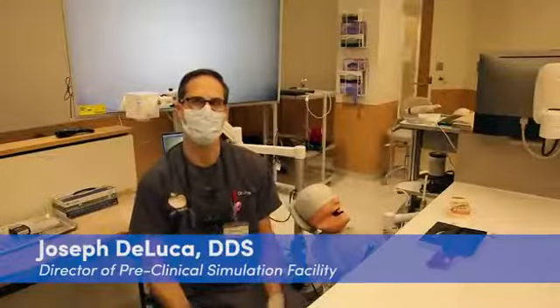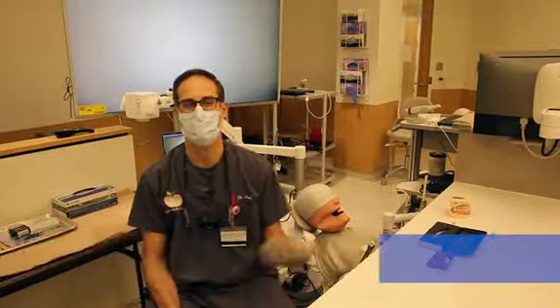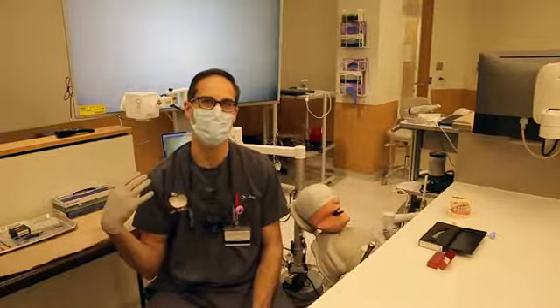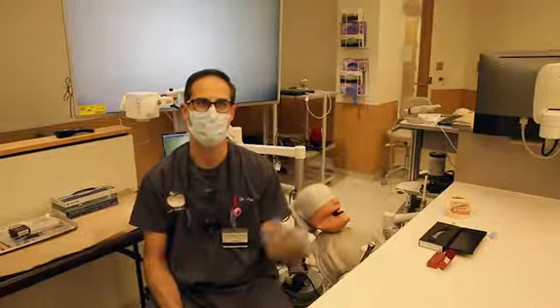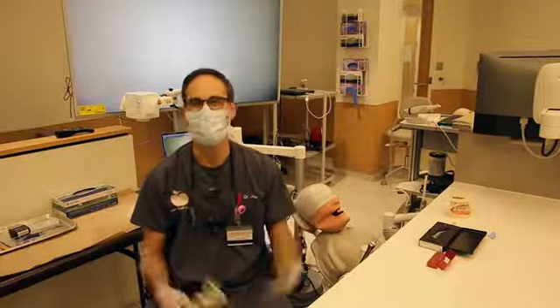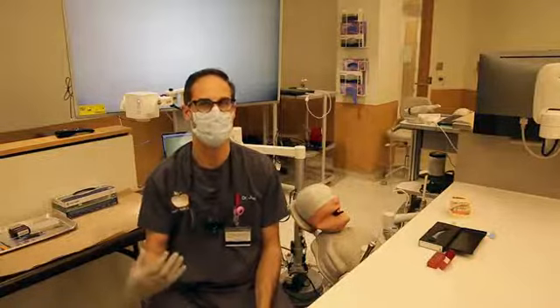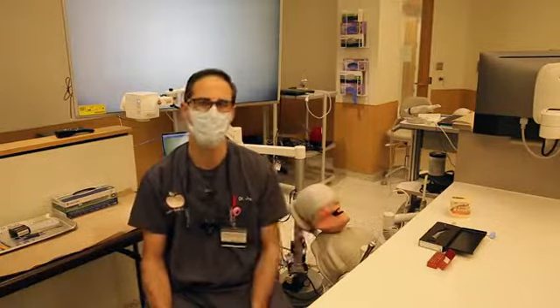So welcome everyone. I'm going to show you a couple of things that we are doing here at the University at Buffalo involving our 3D CAD/CAM technology that we use in the clinic and in the pre-clinic in order to train our students, and also some of the 3D imaging, video imaging that we have in order to teach our students in a more friendly environment, we'll say, an environment where we can actually evaluate student work and give feedback in real time, whether we do it over Zoom or we do it live and in person.